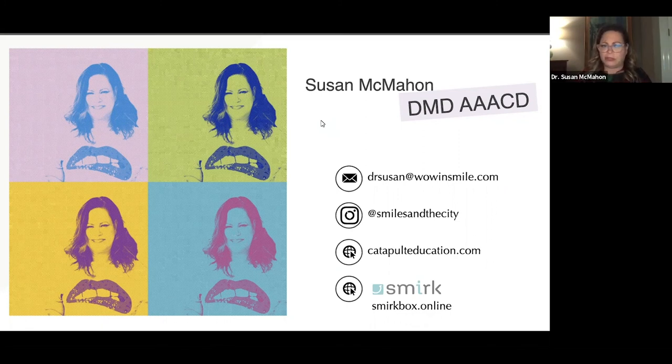So how much time are you spending with it? Design, 10, 15 minutes, Preform, 5 minutes, and then it's going from one thing to the next without much of your time involved at all. Your assistants are moving it over to those things. And then my assistants polish them for me because they're really simple to polish. And they come out pretty close to where you need them to be. They have those little nubs from the supports on them and you just have to run a wheel over them. So they're maybe spending 5 minutes tops polishing it. And then you autoclave, right? Because you're delivering it to somebody and we've got our fingers all over it.